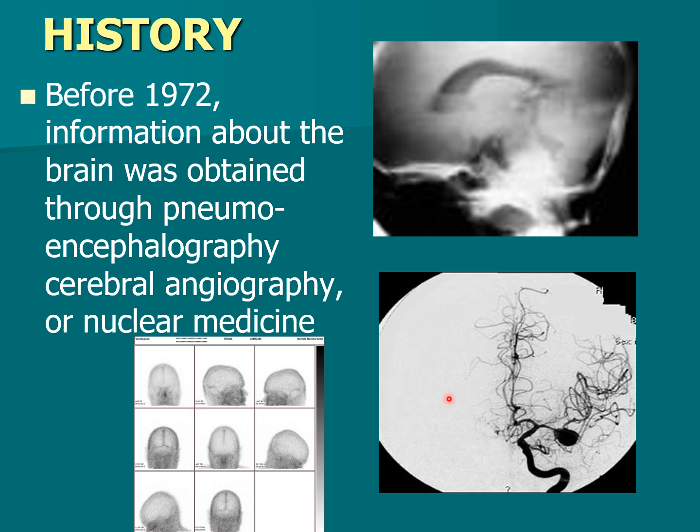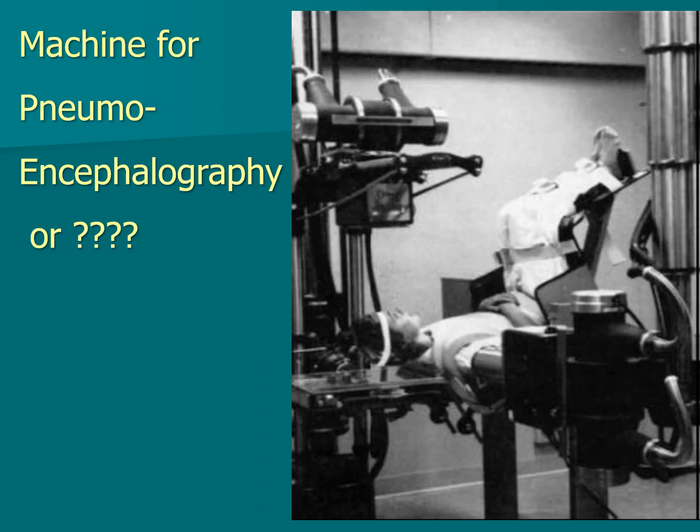And then we could do an angiogram. Here you can clearly see that there's an aneurysm. This would be a carotid angiogram with the anterior cerebral artery and its branches going here, and the middle cerebral artery coming out to the side. This is as if we're facing the patient, so this would be looking at their nose in the midline, and then out to the ears on the side, which would be the middle cerebral artery. And so we could see that. Again, it does not show us the brain tissue itself, but if there was a huge tumor, it might shove all these vessels out of place. So we're looking for displacement, basically.